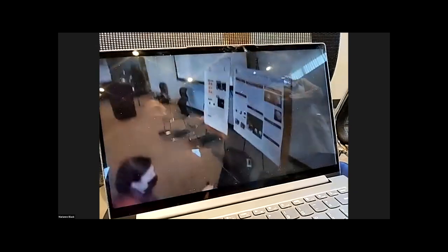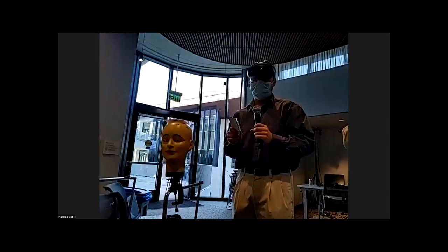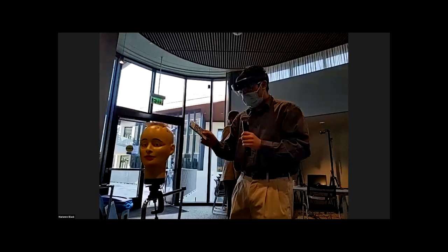The red dot, which is right below the purple line, has a color that corresponds to the magnitude of response. Normally when you fire a probe, for example, in the motor cortex, a muscle might end up twitching because of the stimulation that activates part of the brain. We can measure that response and use that to get an idea of the effect that we have on the brain. The color of this little dot will correspond to the magnitude of the electrical signals that you end up measuring after firing the TMS coil. And that is pretty much the idea behind our demo.